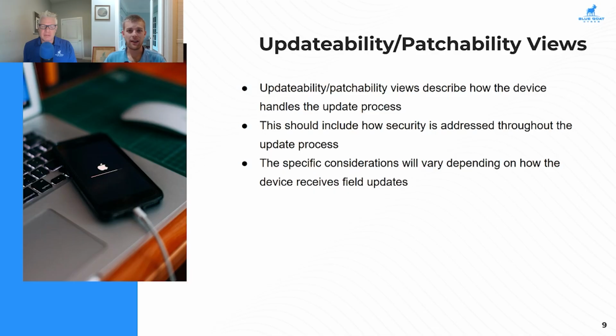Usually that's a cloud-hosted update server, and that can be compromised. The compromise and the downstream effects of that server can be massive. So yeah, there's a higher risk. Obviously, there's a higher benefit to it as well. You don't need to send out a field technician to every site to manually put on a patch. Some devices can have hundreds or thousands of different instances out in the field. Sending out a service technician to all of those has a very long rollout time. And we often see rollout cycles lasting as long as 3 to 6 months with more complicated systems, even from very large companies with the staff to manage it. So there are pros and cons to each approach for sure, and there are security considerations for each as well.